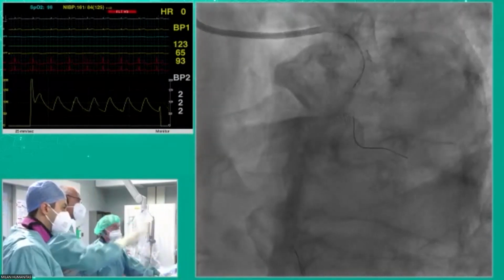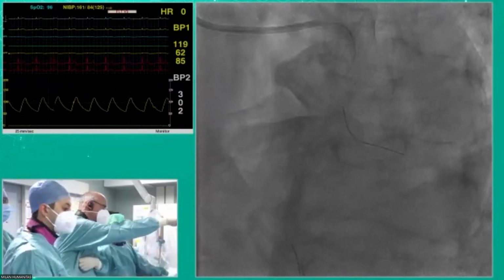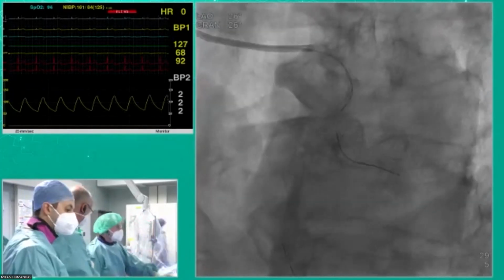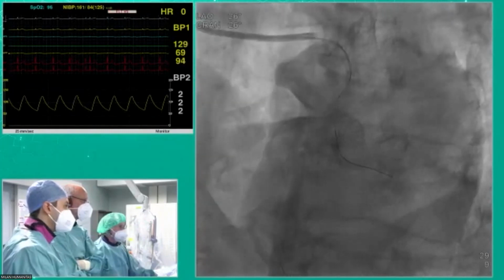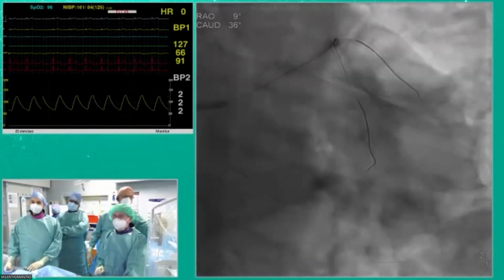No, I think there is staining now. Yeah, but it goes away. You see, clean. No, it doesn't go away. But let's see whether it's still there. Make a picture without dye, whether it's still there. And it seems to me that it is. Flow to the distal apical LAD is still a tad sluggish. Plus, we don't have a DCB, so I'm biased. But that's also deep wall calcium there, too.